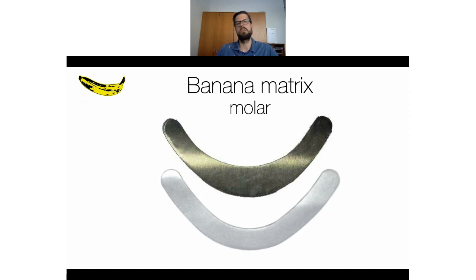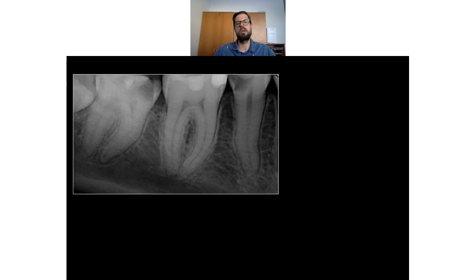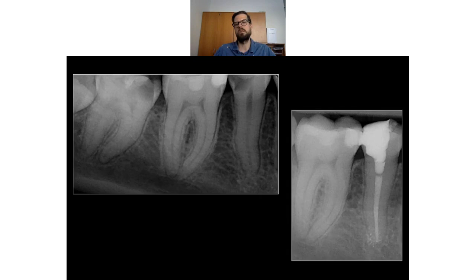So look at this case. This is a young lady, and she has a decay on the second mandibular premolar, and also on the second molar. I managed to not do endo on the second molar, but the premolar was endo. So the first thing when you see such a case is you want to preserve the cervical margin of the dentin, so that it doesn't fall out. So I was very, very, very gentle to it, and it was preserved, so it didn't break.